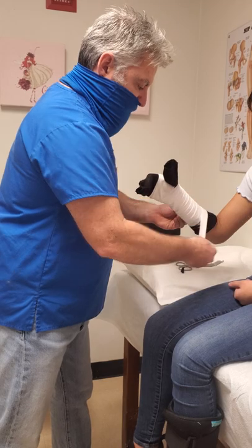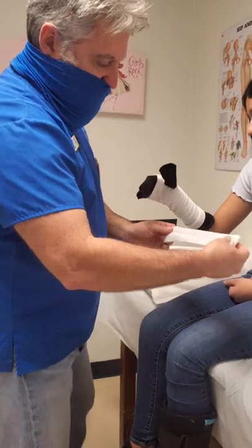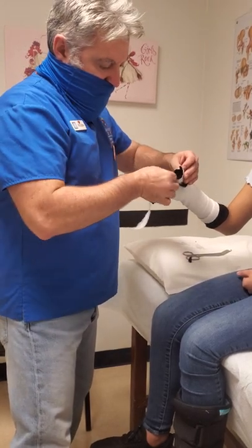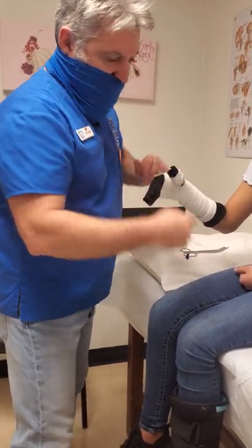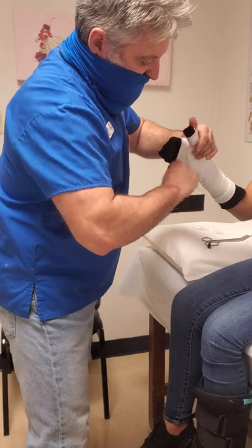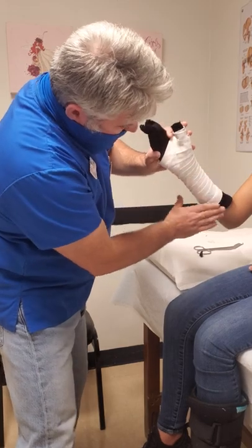Because she's pediatrics, I'll go ahead and add a little extra on the edges so that it doesn't rub on her as she's being active. Then we're going to incorporate the thumb as well. A nice trick for the smaller thumbs — you take your patty and split it in half, then wrap the thumb like so. That way it's not too bulky when you go to put the cast on. The black stockinette is good for demonstration purposes because you can see where the cotton is thin and where you need to reinforce. We're going to reinforce a couple of thin spots with the scraps we have left, then proceed to the fiberglass cast.